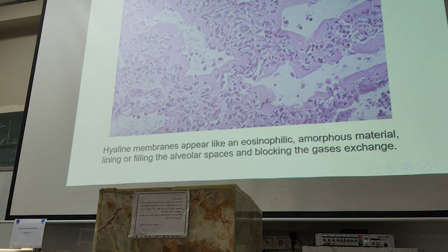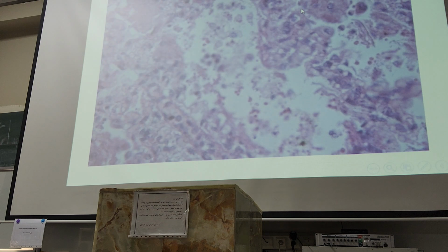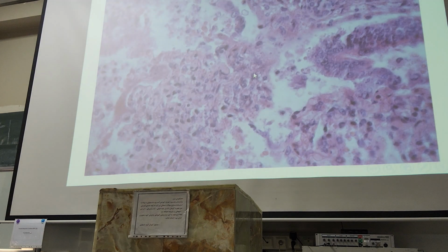This is also hyaline membrane. And in high power, you can see hyaline membrane here also.